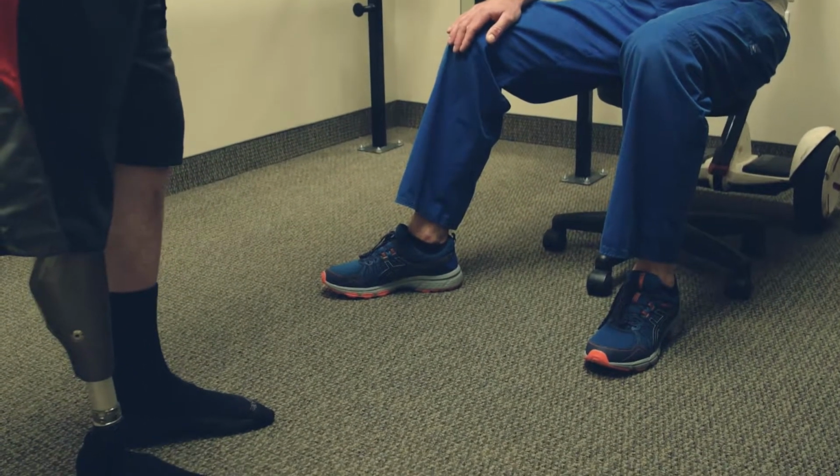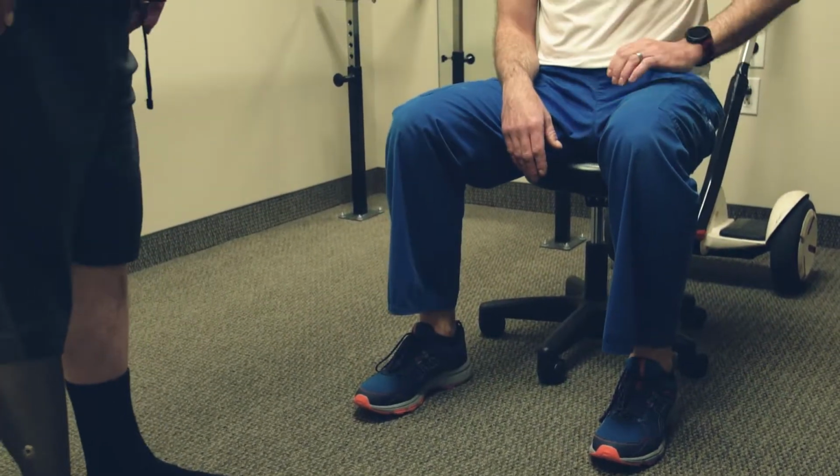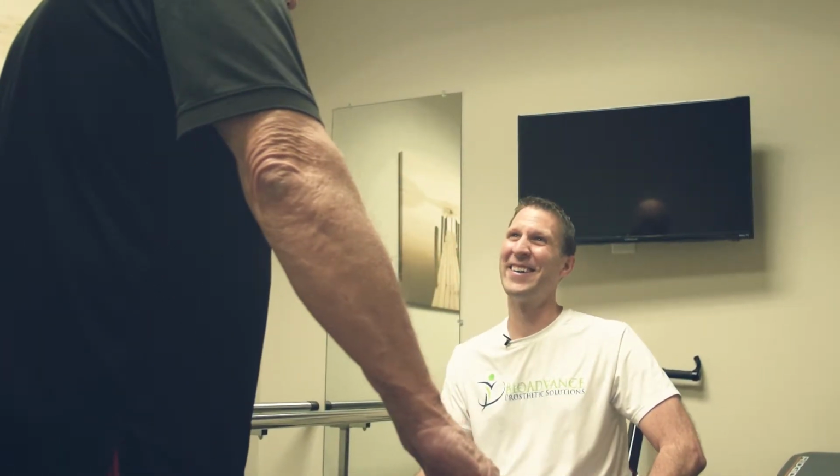All right. Do you mind putting your shoes on? Okay, I guess I can. You know, I walk around in the house all the time with just my stocking feet. All right. Let's try it. Now, is that something I shouldn't be normally doing? Well, I'll check everything and make sure. What it does is it changes your alignment when you walk barefoot. So as long as you're okay with it, it's probably fine. It's just when I'm at the house. I guess there's a little more elevation in the shoes. Yeah, it changes the alignment, but it does now explain the hole in your sock. And it wears a hole in my shoe too. Oh, does it? Yeah, it's just a little inside.